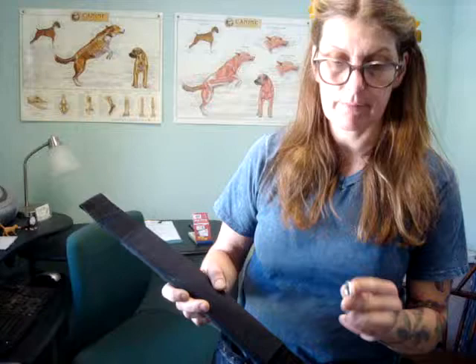Hi, this is a little video we're putting together about how to remove the yoke to put on a support strap or a belly strap on an Eddie's Wheels cart, and here is Nina to show you how to do it.